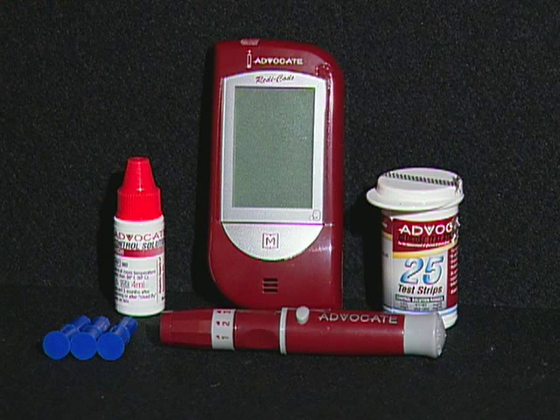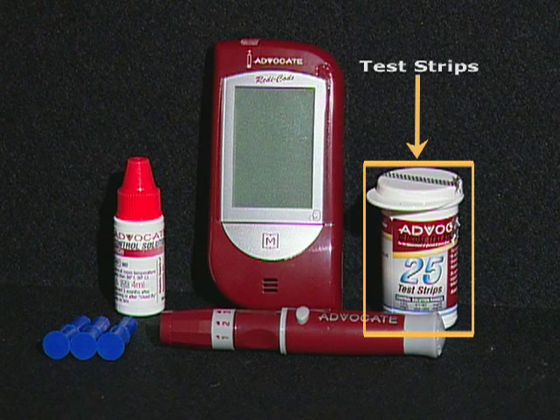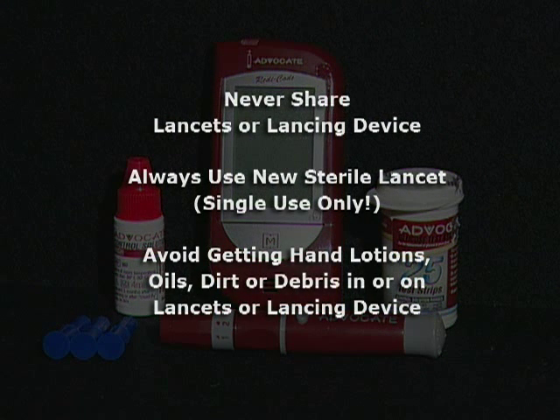When testing your blood glucose, make sure you have all the items needed to test: the blood glucose meter, test strips, the lancing device, and a sterile lancet. To reduce the chance of infection, never share a lancet or the lancing device with anyone.